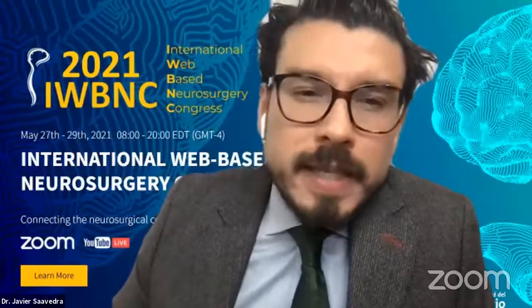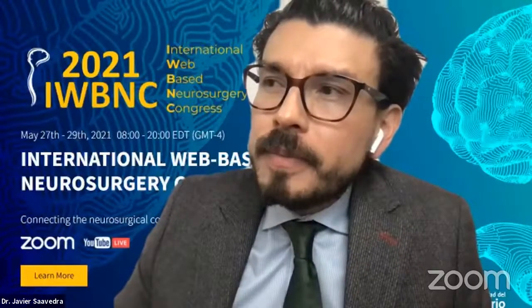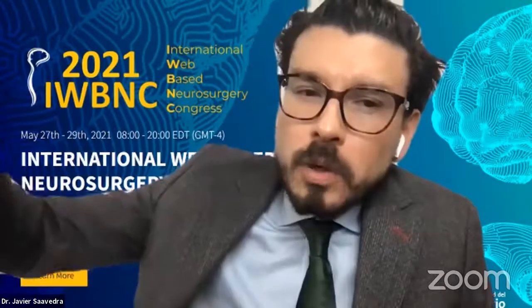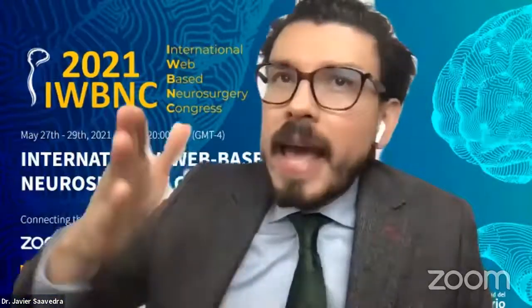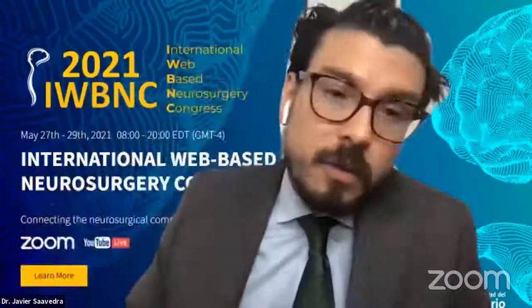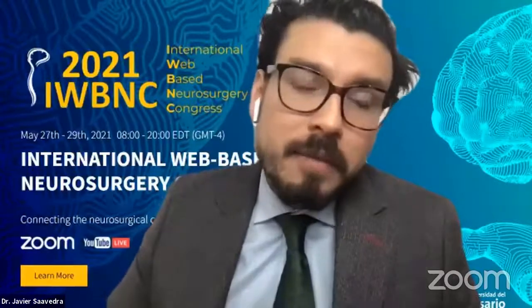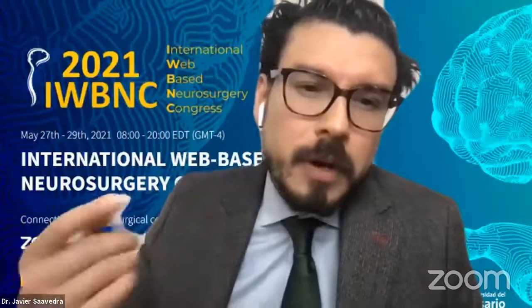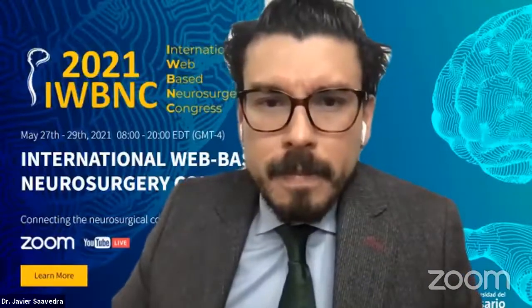More frequently, transnasal approaches, because the TONES approach will give you access to the lateral portion of the middle skull base, and also you have access to the very lateral portion of the temporal lobe. But if it's really lateral, then you won't get to put the scope in this direction. So in that moment, you will have to perform an open approach, maybe a minimally invasive open approach, like a mini-pterional approach, will be useful, and that has been done. Okay, thank you.